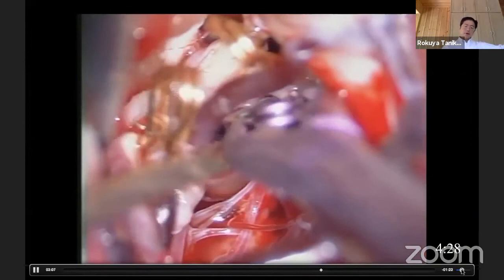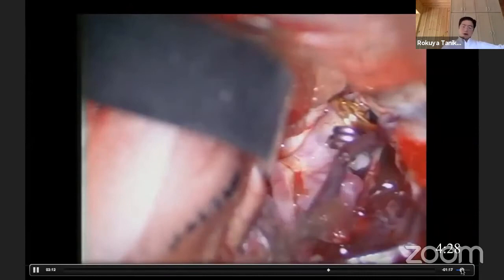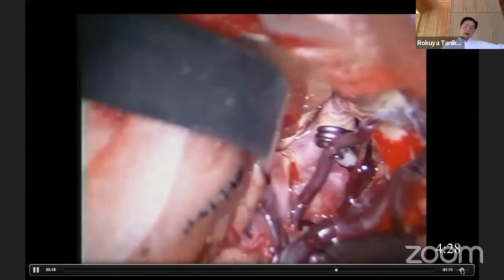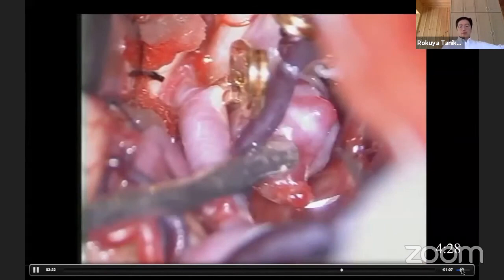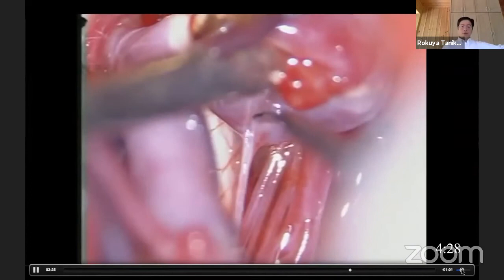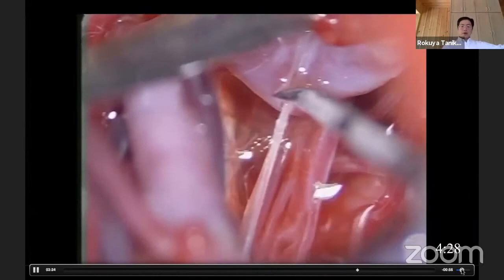This is the first clipping of the PCOM aneurysm. The choroidal artery aneurysm is bigger and still unruptured. I temporarily deflowed the ICA. Then after recovery of the patient, I put a temporary clip to trap the aneurysm. The problem is the very strong adhesion of the anterior choroidal artery.